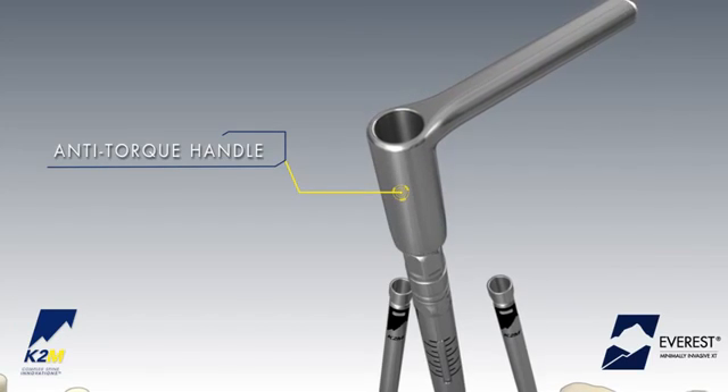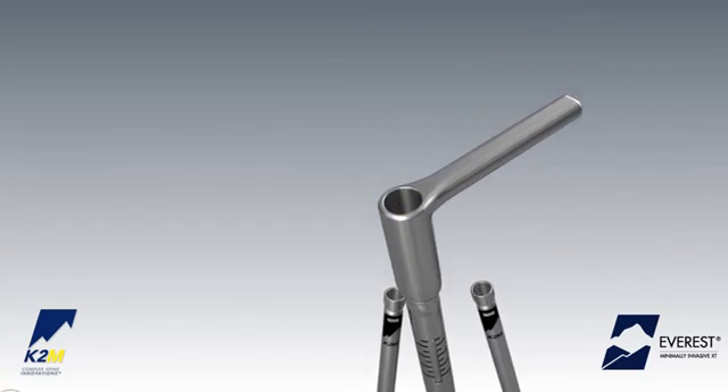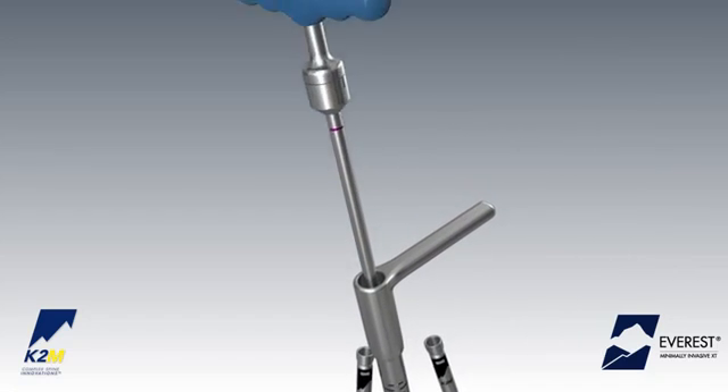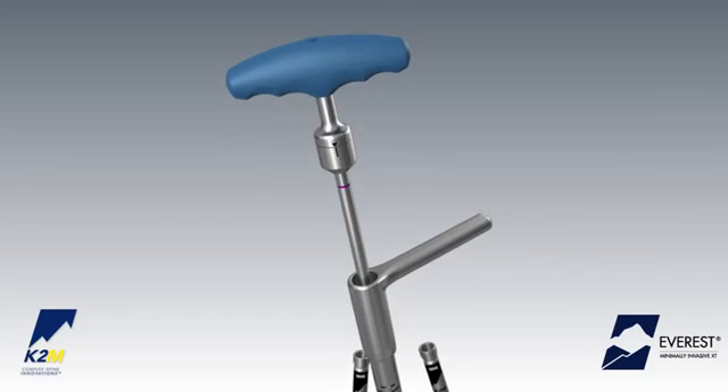Slide the anti-torque handle over the tab reduction tunnel until it is properly seated on the instrument. Place the torque indicating wrench down the cannula of the tab reduction tunnel.